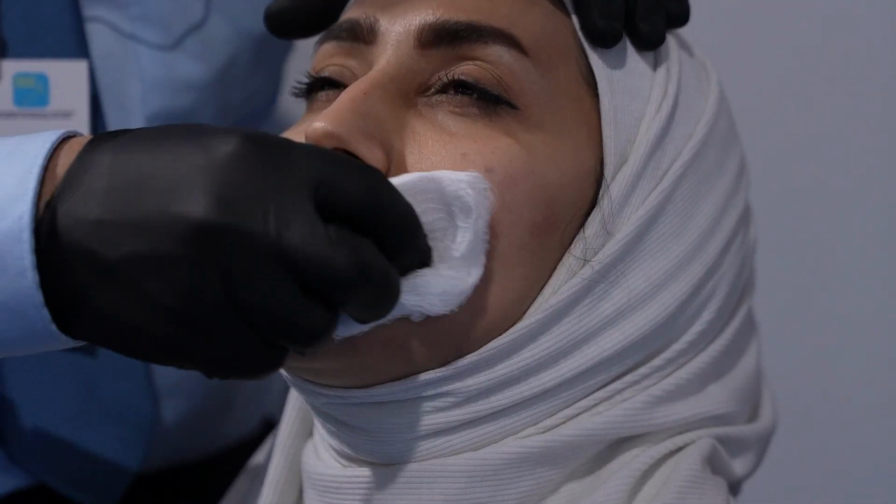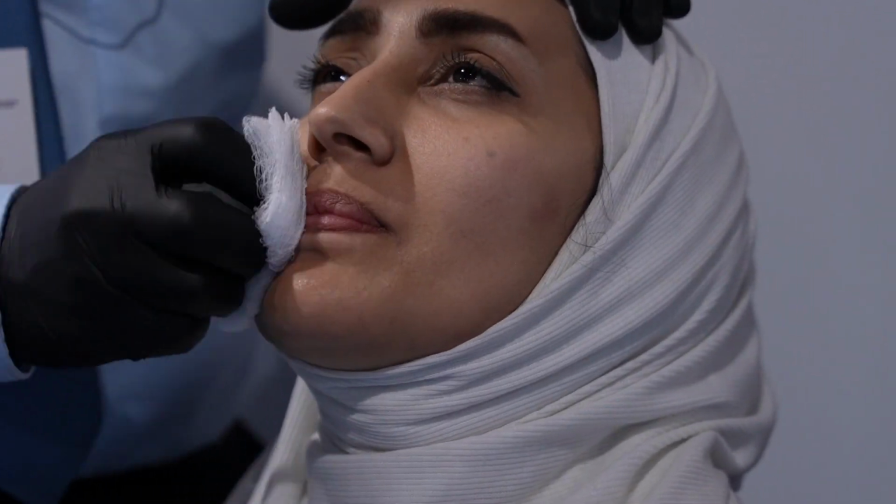You know that the most important thing we as doctors in our offices must do is keep all the obligations of infection control. We are doing an injection, but it is not for a long period. It means that we are in a semi-critical setting, so we should wear not these gloves but sterile gloves from the pouch, and disinfect the lips or the area where we are going to inject. The majority of side effects are due to that.